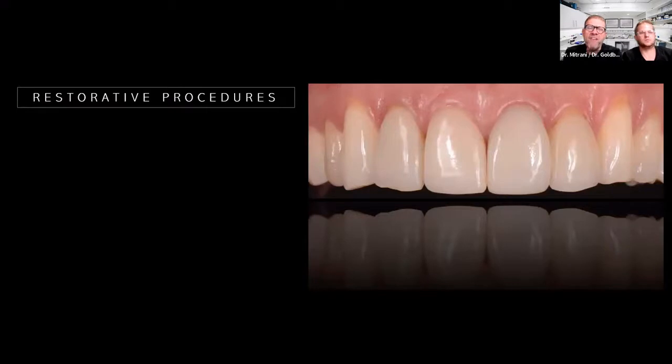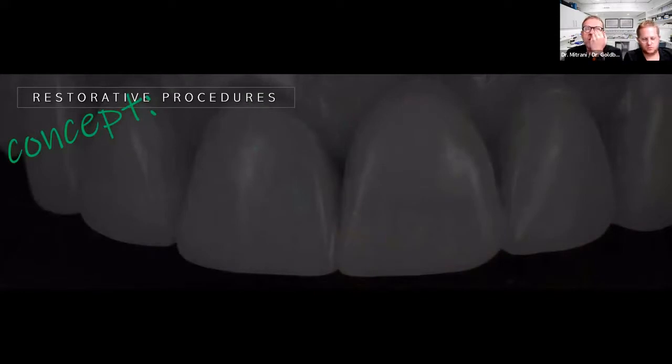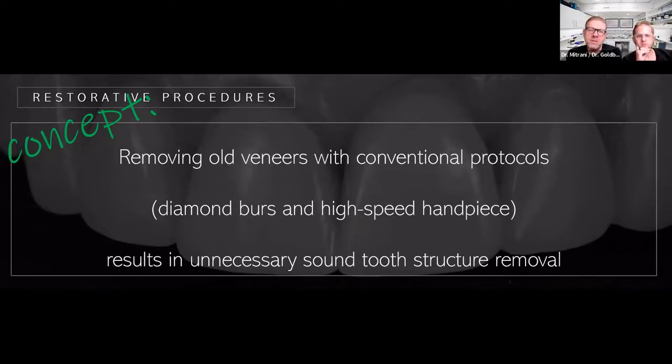So conceptually, when we have patients coming in with ceramic veneers that require a change because the patients are no longer satisfied with the aesthetics of it, why would we even think of utilizing the laser unit? Well, this is the question that arises all the time when we're challenging previous technology. Why utilize something if the conventional approach works so well? Well, I guess we can all argue that while removing previous restorations, particularly ceramic veneers, it's almost next to impossible for us to do so with a conventional diamond burr high-speed handpiece without removing at some points unnecessarily some sound tooth structure.